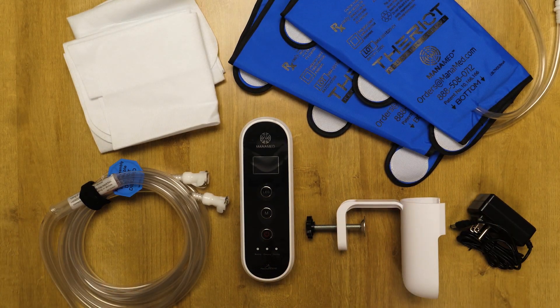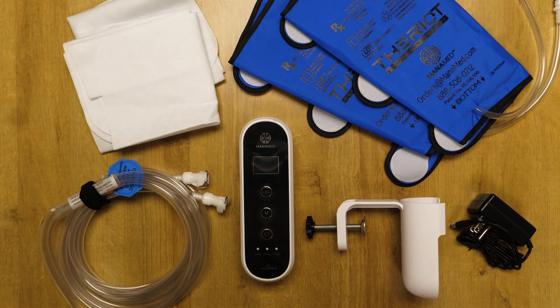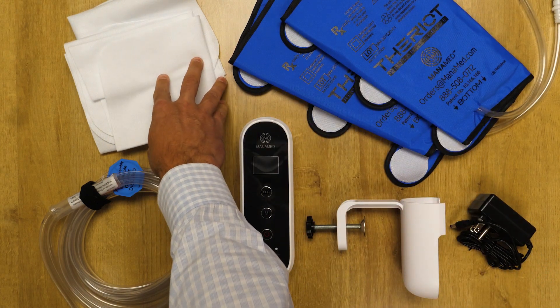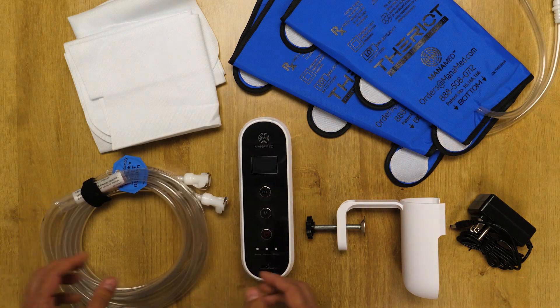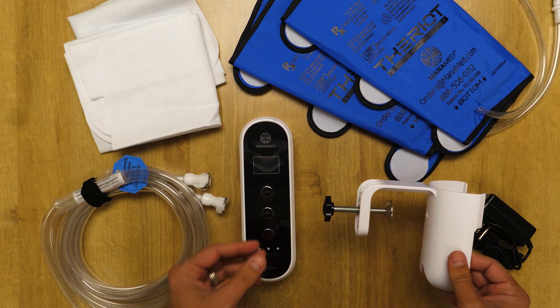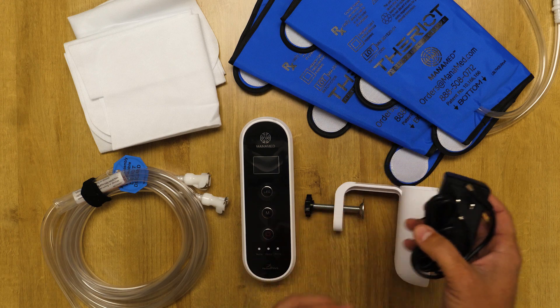This is the PlasmaWave laid out for a surgery center or hospital that wants to use the eco-friendly green option. We have a pair of the reusable sleeves, a pair of the disposable barriers, a set of reusable tubing, the unit, the bed rack to clip it to the bed, and a three-prong grounded charger.